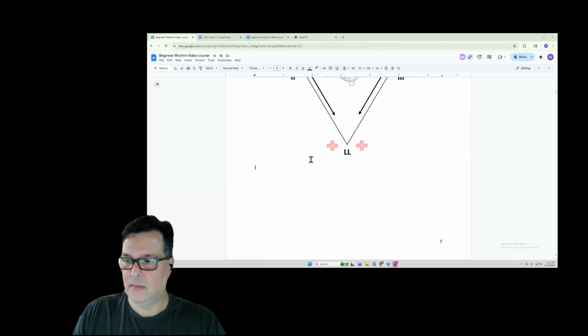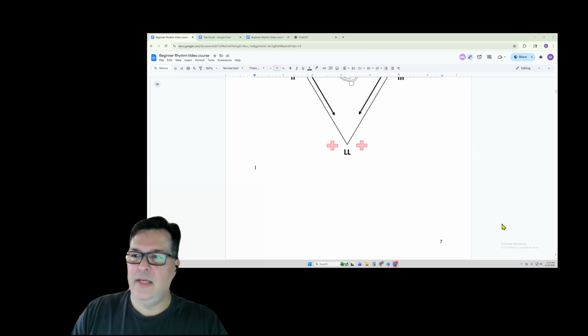Leanne will say that she often gets calls and it looks like the leads are just not in the right place. Oftentimes it can be fixed because the leads aren't sitting right. So leads need to be changed daily. Is that still the process, Emily, for nursing, daily lead change?